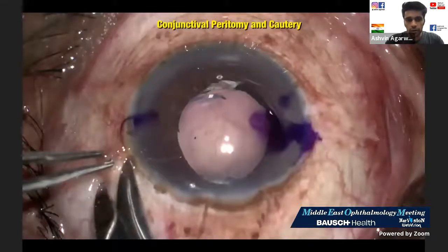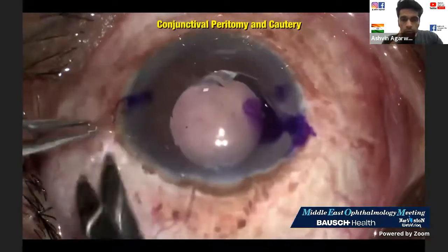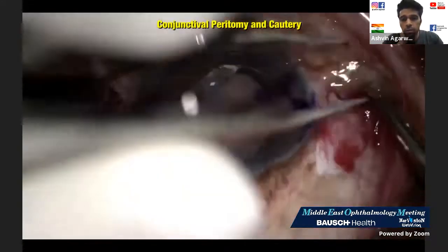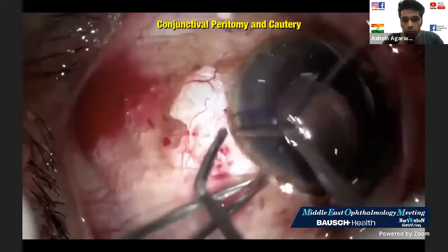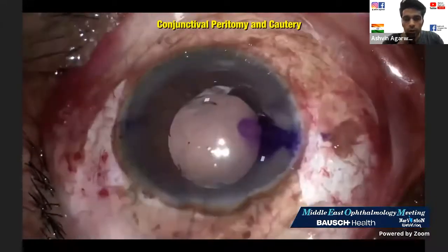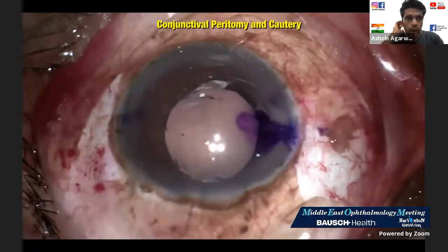Surgical procedure, let's dig straight into it. First up, we really need to make a conjunctival peritomy and cautery at 3 and 9 o'clock position. This depends basically on one major fact, the horizontal white to white. If the horizontal white to white is anywhere below 12 millimeters, I will make it at 3 and 9 o'clock. If it's above 12 millimeters, I will go vertical, because the vertical white to white is always going to be a little smaller or shorter than the horizontal.